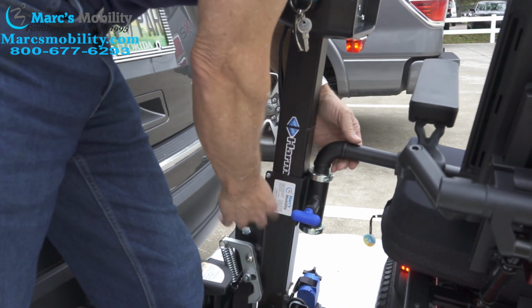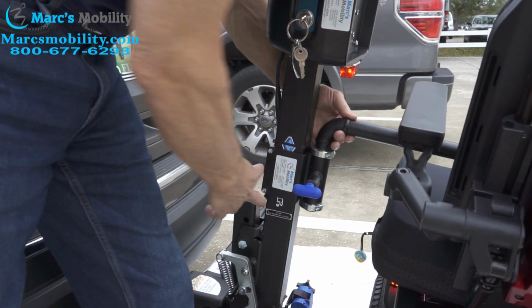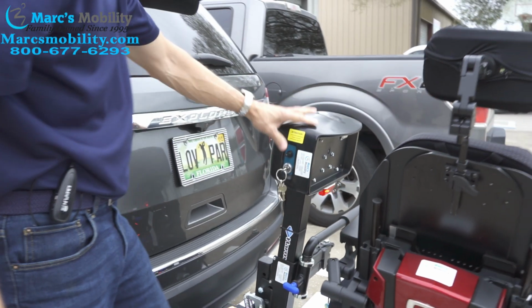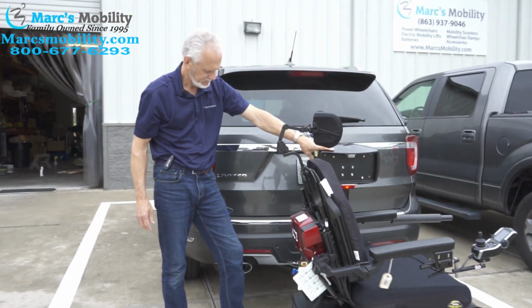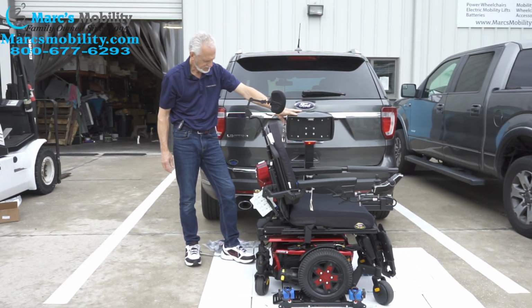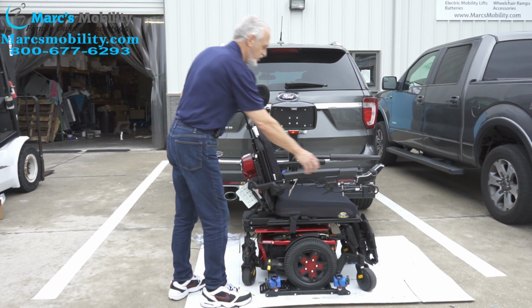So you can see the 2 screws. You can see how the arm can be elevated. So you'll have to adjust this arm, tighten up these screws when you get your lift. And then you just take your chair off.